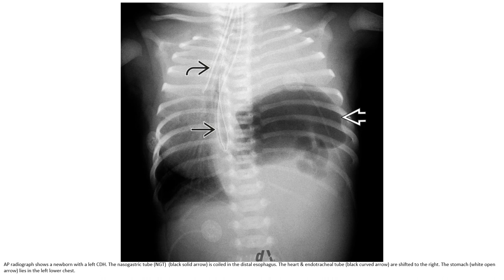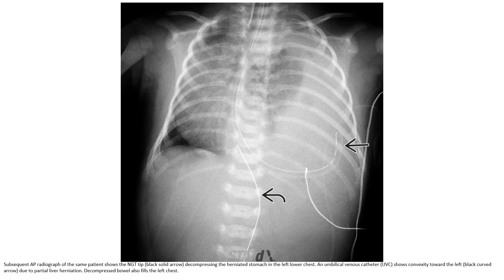AP radiographs of a newborn with left congenital diaphragmatic hernia. The nasogastric tube is quite in the distal esophagus. The heart and endotracheal tube shift to the right. The stomach lies in the left lower chest. Subsequent AP radiographs in the same patient show the nasogastric tube decompressing the stomach in the left lower chest, with umbilical venous catheter convexity toward the left due to partial liver herniation.